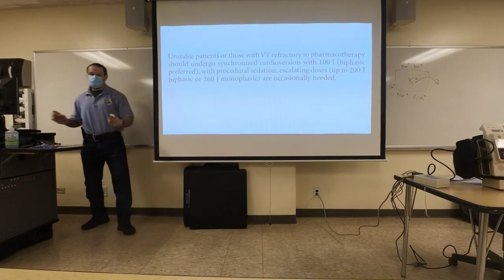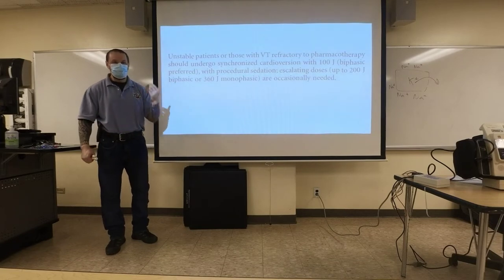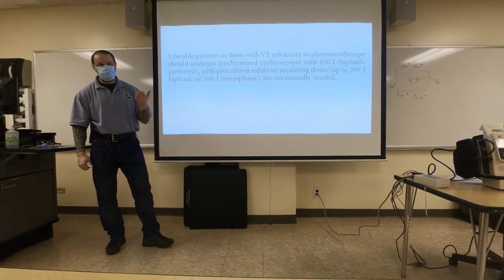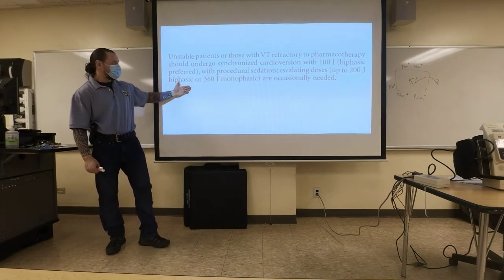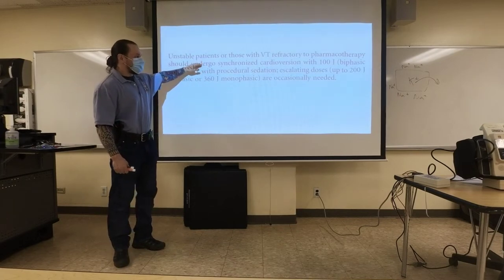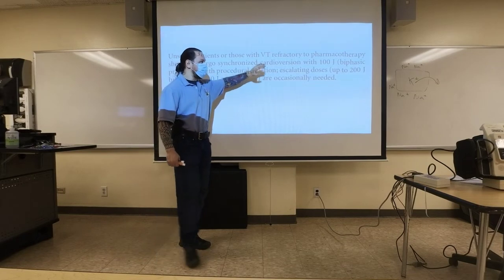And then for unstable patients, those who have hypotension, altered mental status, shortness of breath, confusion, we're going to go with electricity, electrical therapy. So basically, any ventricular tachycardia that's either unstable or refractory to pharmacological intervention.